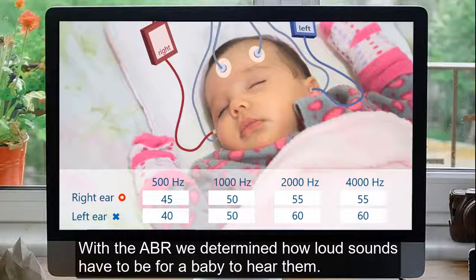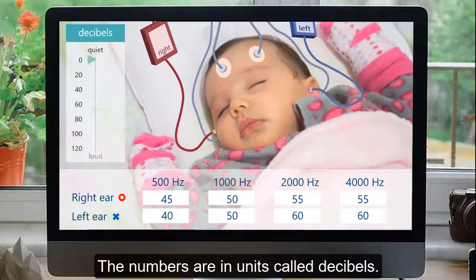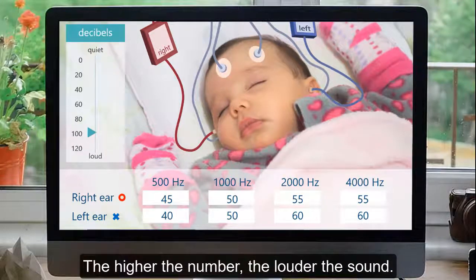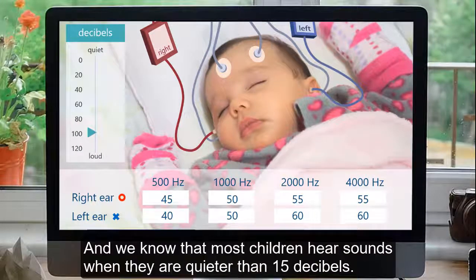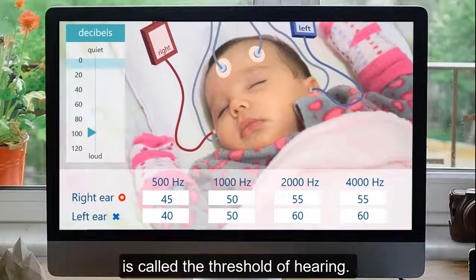With the ABR, we determined how loud sounds have to be for a baby to hear them. The numbers are in units called decibels. The higher the number, the louder the sound. Most children hear sounds when they are quieter than 15 decibels. The point at which a child just begins to hear the sounds that are quiet for them is called the threshold of hearing.